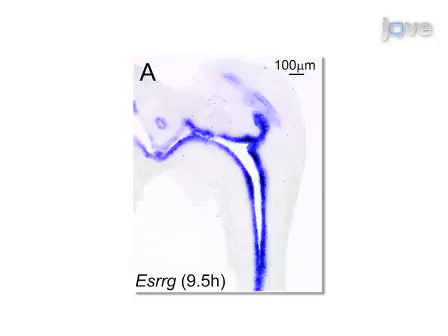The main advantage of this technique over existing methods, like immunohistochemistry, is that riboprobes are easy to generate and can be made to recognize most mRNAs in the entire mouse genome. Though this method provides insight into mRNA expression patterns during fetal mouse genitourinary development, it can also be applied to other organ systems, species, and developmental stages.